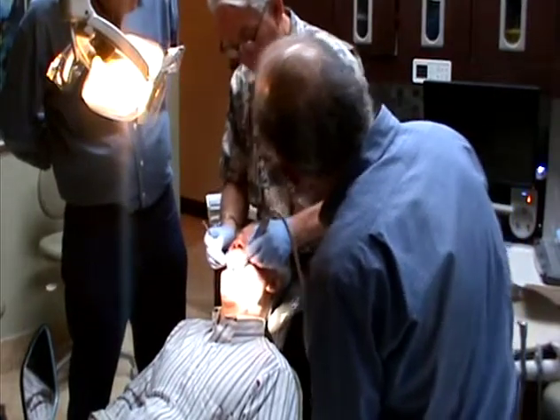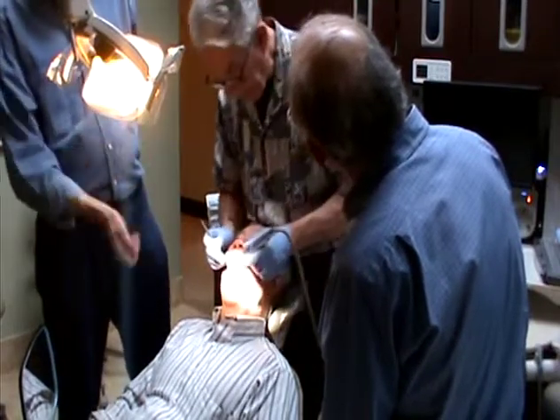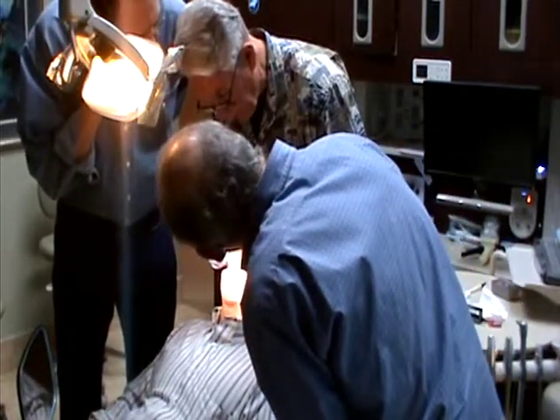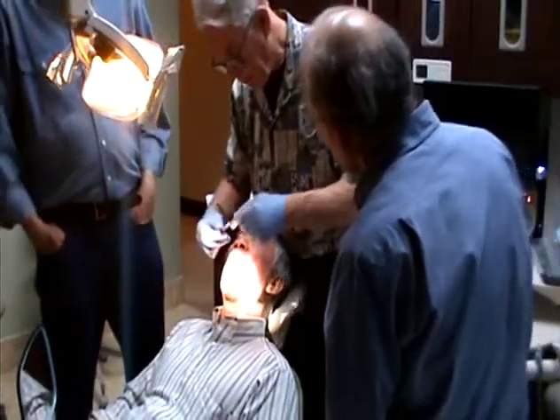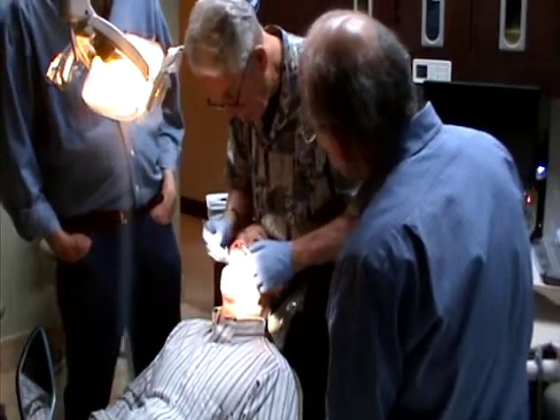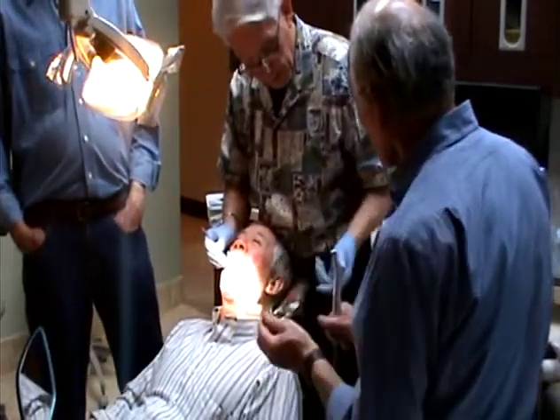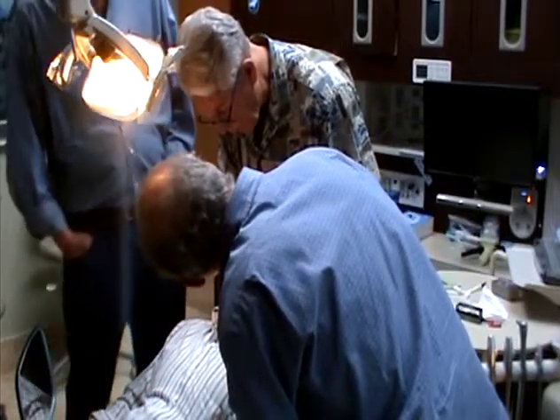If I take that whole thing out, then that changes his entire bite. So if you have him just eccentric, it's going to be right there, it'll be in red, huh? Yeah, it was right in the middle right there. See, now he can slide over that without banging on it. Like that, slide. Still a little bit more just on that edge. But maybe I get somewhere good. Oh, occlusion straight now.